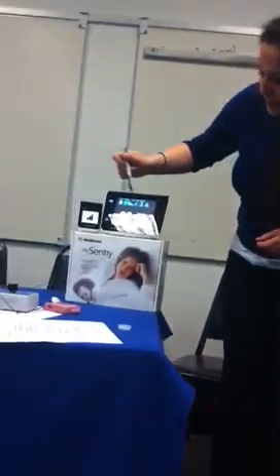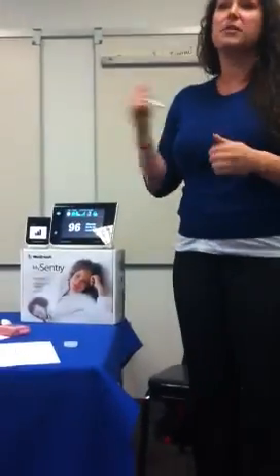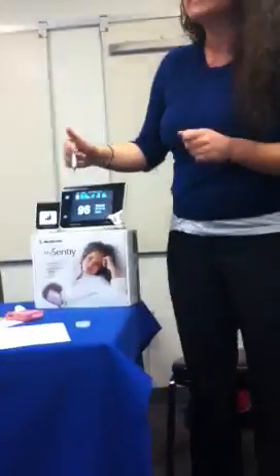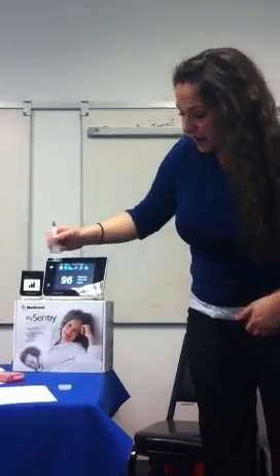So as you can see, this is the home screen that we're currently on right now, and so what that does is that displays the sensor glucose value. Using the sensor is really important with the mySentry because that's how you're going to get the most value, to be able to see those sensor glucose readings, as you guys are all aware. So this will show your sensor glucose, and that's transmitted every 5 to 7 minutes as it's being read by the sensor. And so that's transmitted to the monitor.